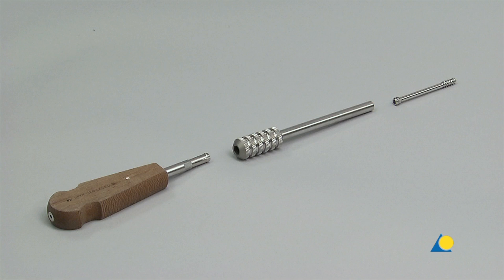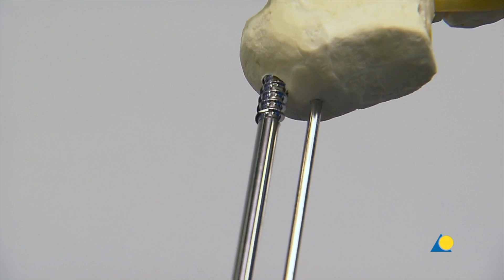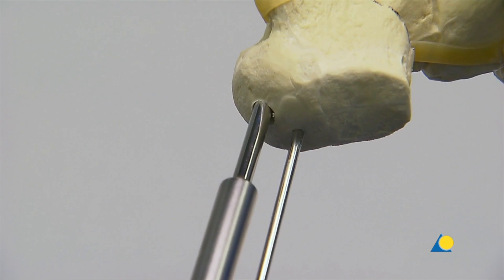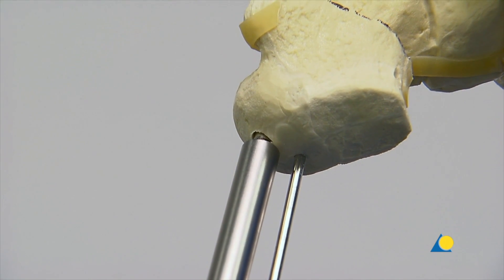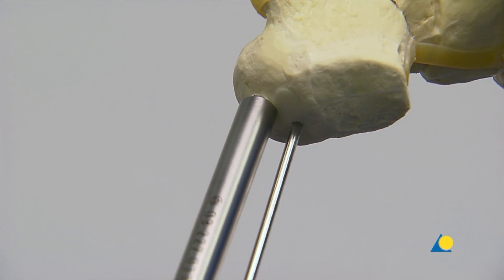The compression sleeve handle is inserted in the compression sleeve, and the screw is threaded into the end of the sleeve. The cannulated 6.5 mm hexagonal screwdriver is used later to countersink the screw into the bone. The screw and compression sleeve are advanced over the guide wire. Compression of the osteotomy occurs when the compression sleeve contacts the cortex. Care must be taken not to over-tighten, as this will cause a loss of purchase of the threads in the bone.